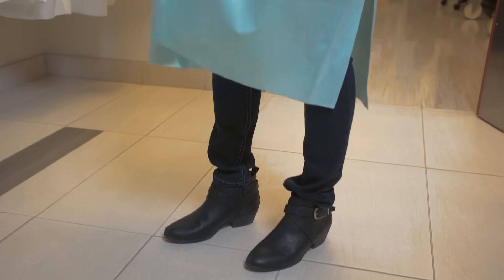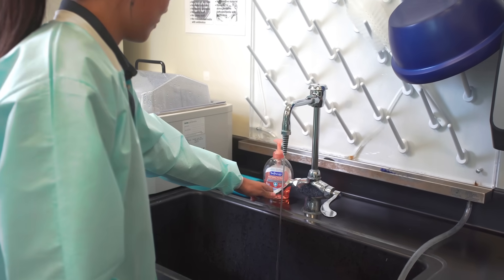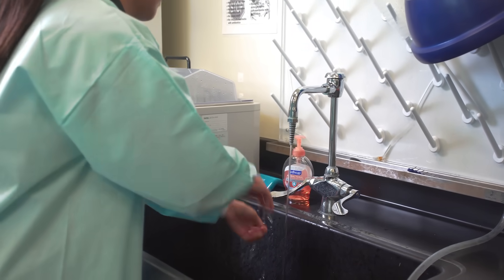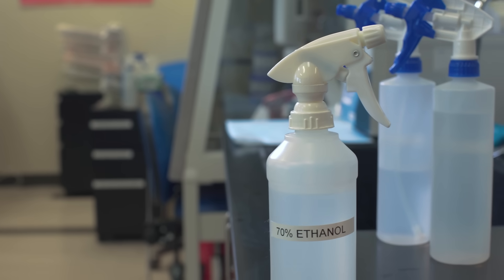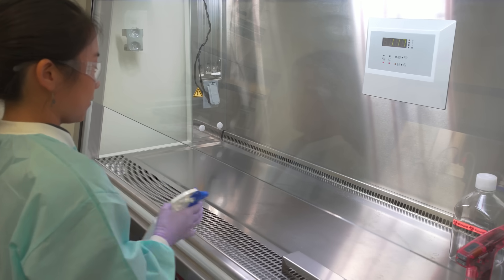Wear closed-toed shoes and clothes that cover your legs. Washing your hands before handling cells or performing culture work removes bacteria and microscopic dead skin particles. Dead skin cells can be a potential source of contamination. A 70% ethanol wash kills microorganisms that could contaminate the cultures.